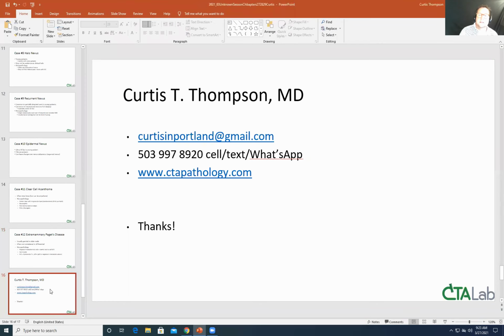So that is it. Thank you very much. Hope these were somewhat educational. I know the melanocytic is a huge subject, and there's not enough bandwidth to talk about all the subtleties of melanocytic, but hopefully you're picking that up over time in different ways. And I also skipped over most of the basal cell, squamous cell components because you also get a large amount of experience with that just in your daily work.